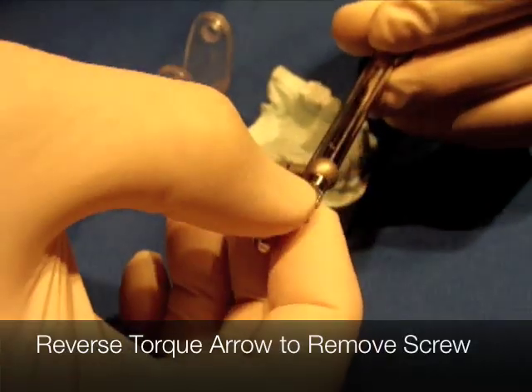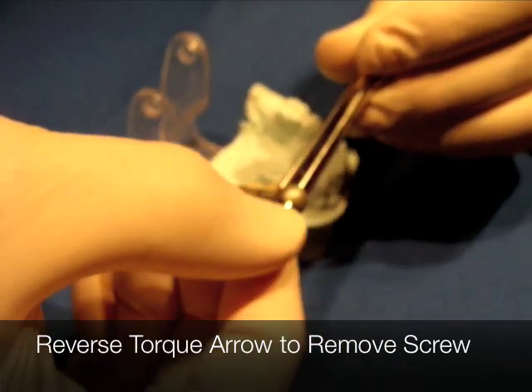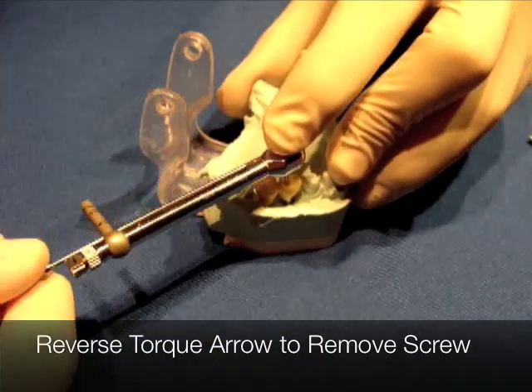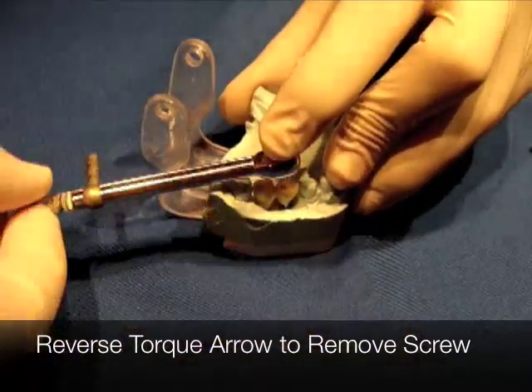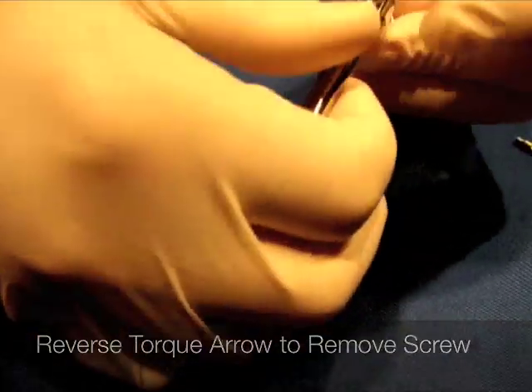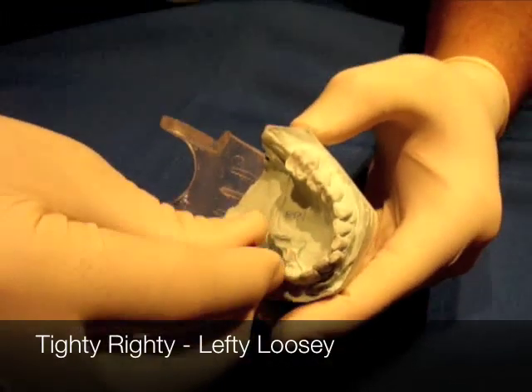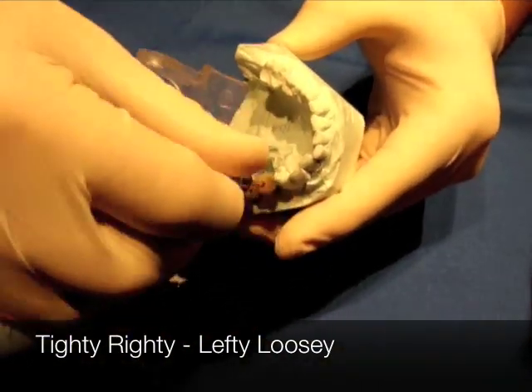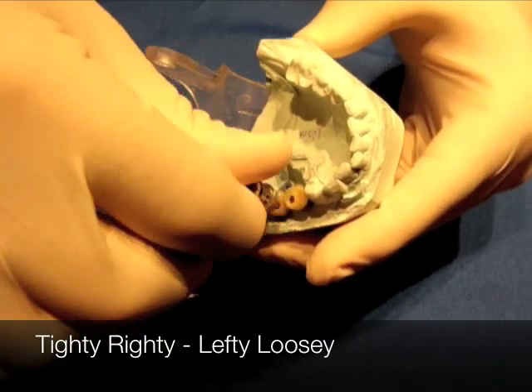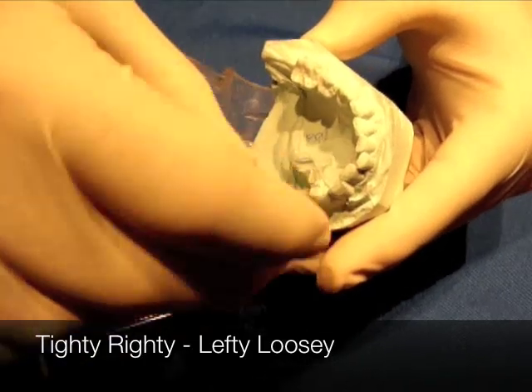If I wanted to remove it, I would take this little arrow, pull it out and turn it. As I turn it, I can put it back inside and rotate backwards — that rotates and takes it out. Once I get them loose, I'm able to take the driver back out and loosen this up. You want to be taking x-rays, of course, before you tighten things down too far.